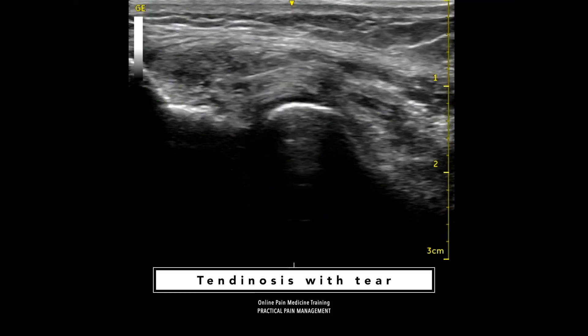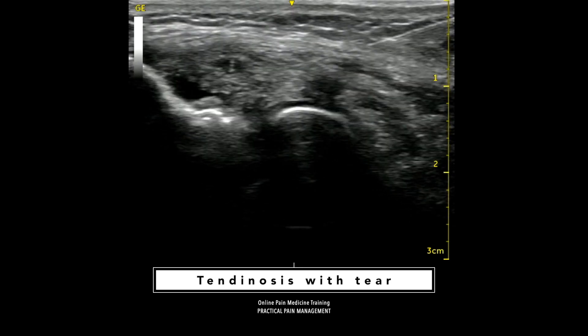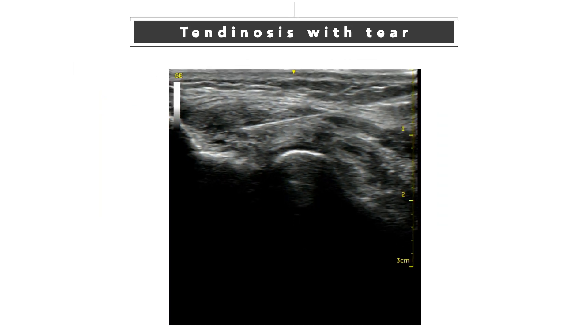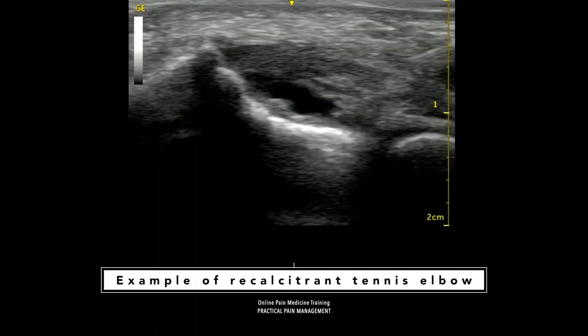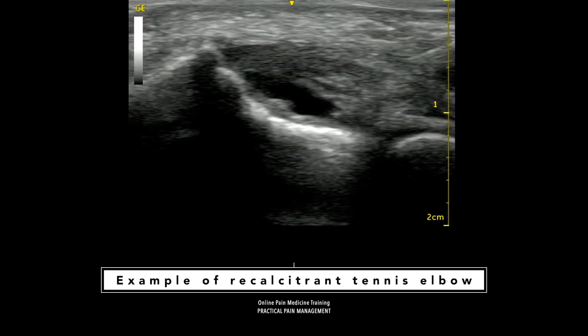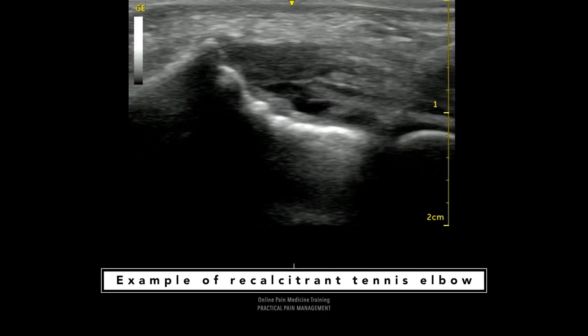This video shows a microscopic feature of tennis elbow. According to my observation study, tendonosis and tear are the significant causes of chronic intractable tennis elbow. This video is another example of recalcitrant tennis elbow, where tear extends from the collateral ligament and deep portion of the common extensor tendon.